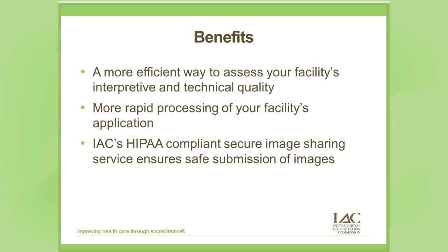I see a few comments in the polling thing asking, is it easier for IAC to view images in DICOM format, or should I include the viewer that is uploaded with my files? Include a viewer all the time when you upload your files because some DICOM is proprietary to whatever software vendor you use. So always include that viewer. It will help us. And that's speaking for Echo. I don't know if the other divisions have anything else to say, but for Echo, always include a viewer.